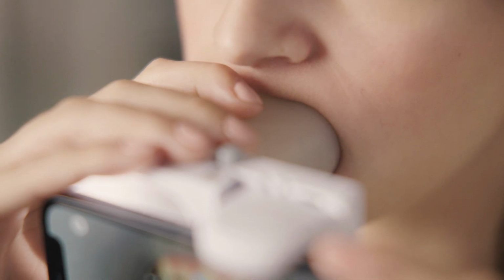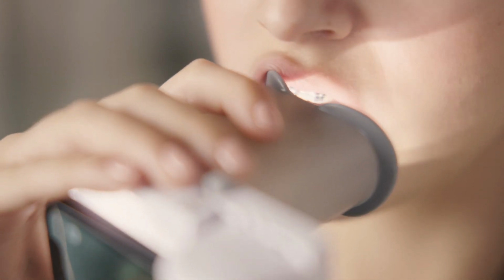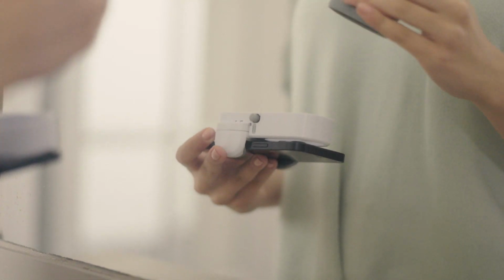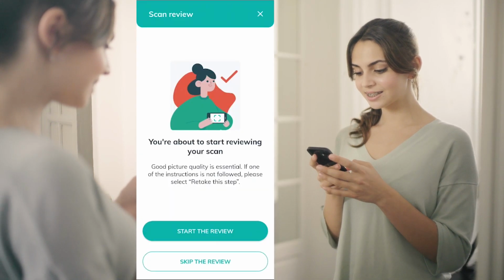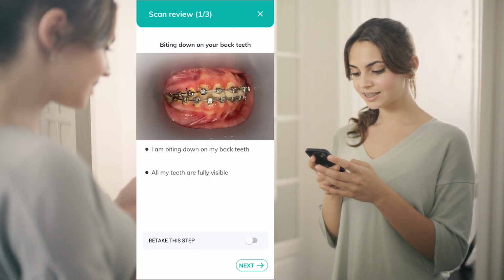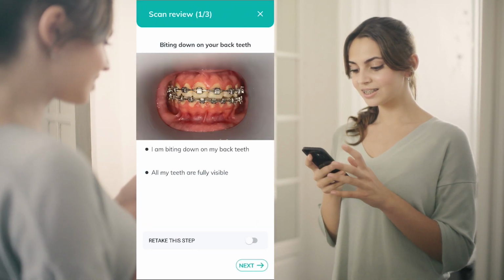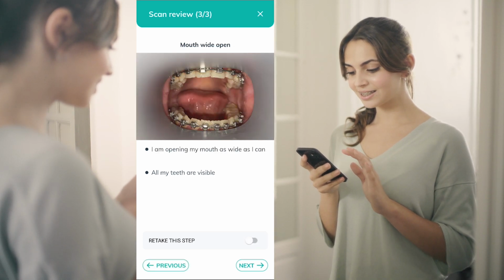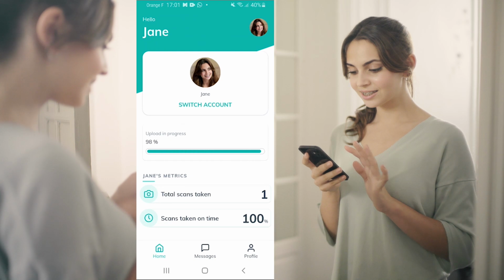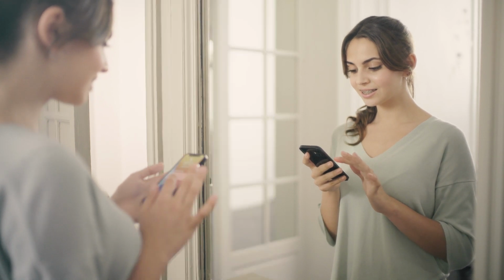Take the cheek retractor tube out of your mouth and remove it from the phone support by holding the phone support in place and pulling the cheek retractor tube forward. Take the time to review your pictures. If your pictures do not follow the on-screen instructions, you can simply retake them. Once all your pictures have been validated, you can send your scan. That's it! Now it's your turn to try out your first scan.